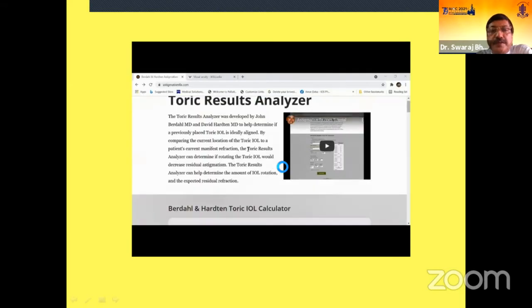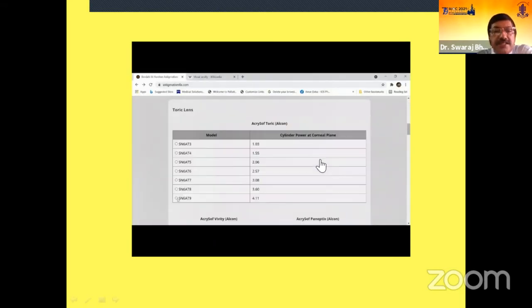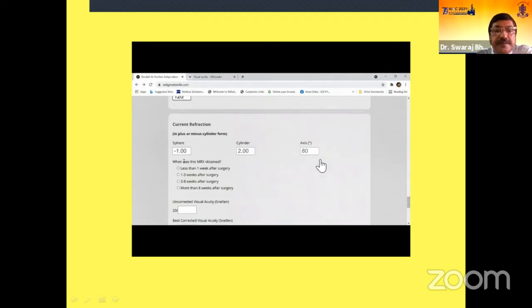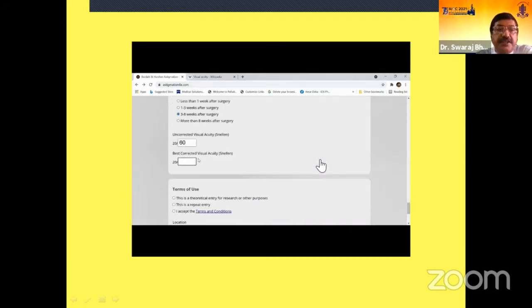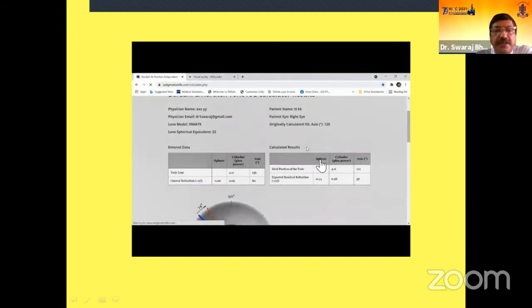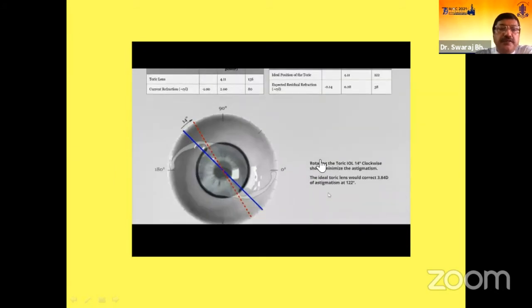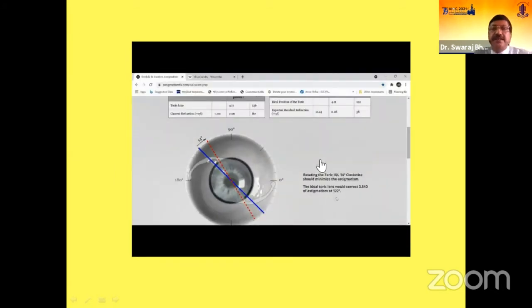Here is a small video demonstration. We put in the input data — the IOL, desired refraction, the current refraction, uncorrected visual acuity — and go for calculation. The website gives us the calculation and shows that if we do a 14-degree clockwise rotation, we get the desired result.